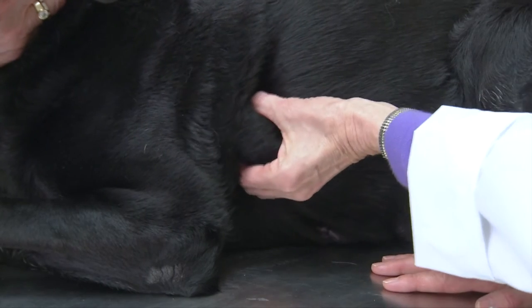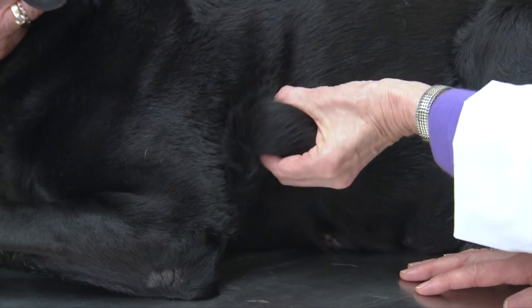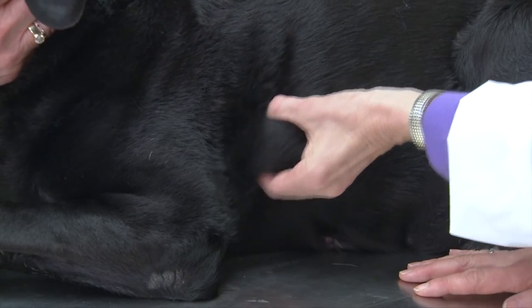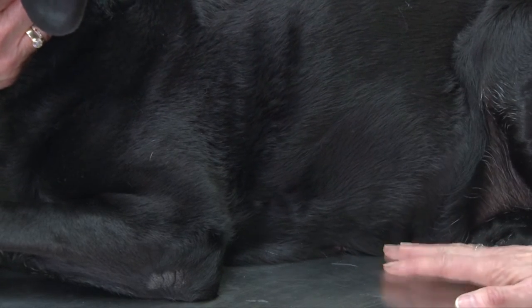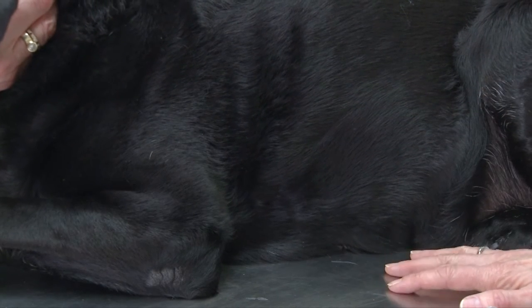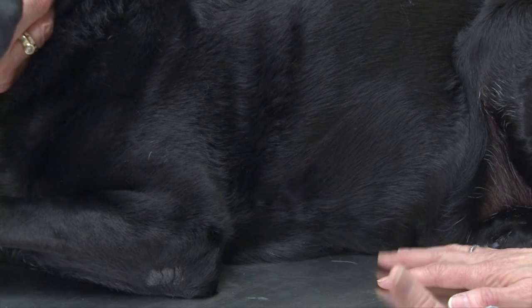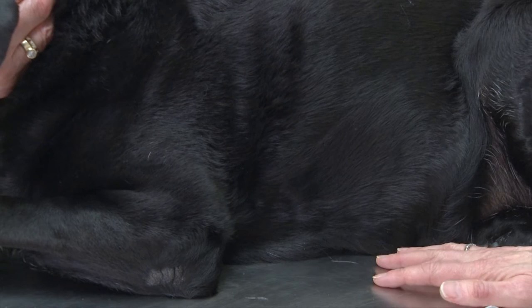This dog has a lump behind her elbow, which you can visualize here. I'm holding it in my left hand. This is a procedure that is well tolerated by animals because it really doesn't cause much pain. It's the same type of procedure as we would use for vaccinating a dog, where we're simply sticking a needle into the skin and tissue.